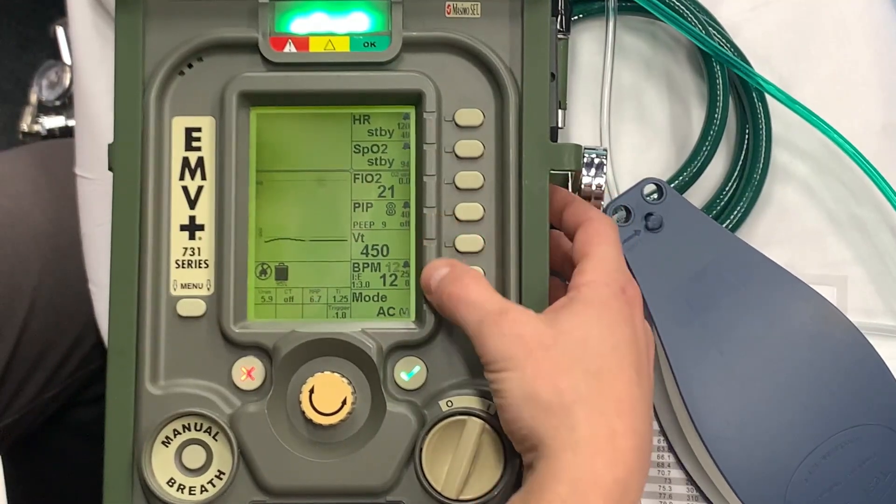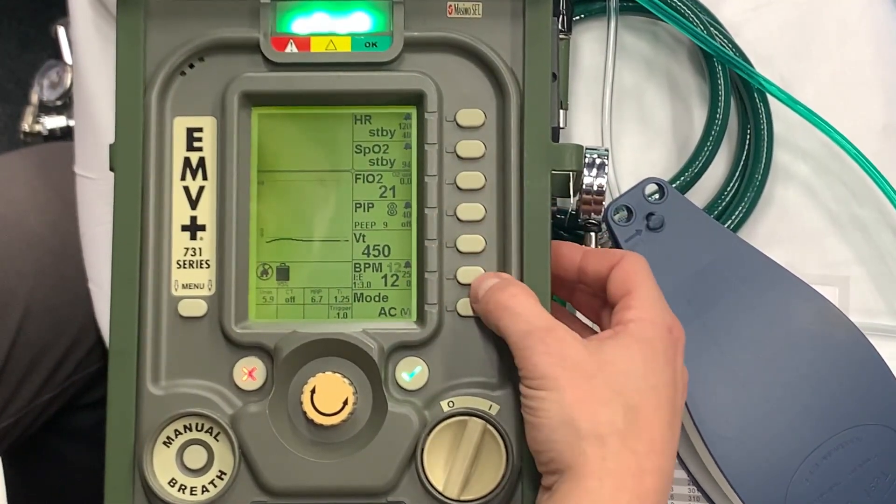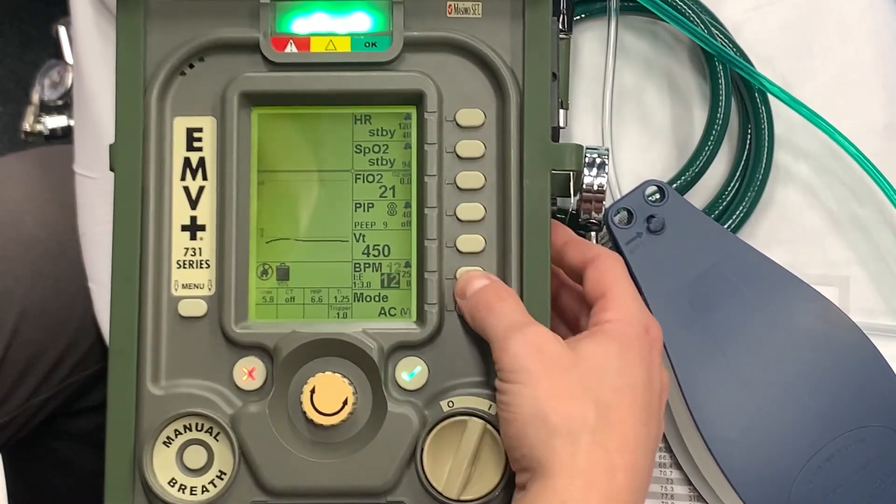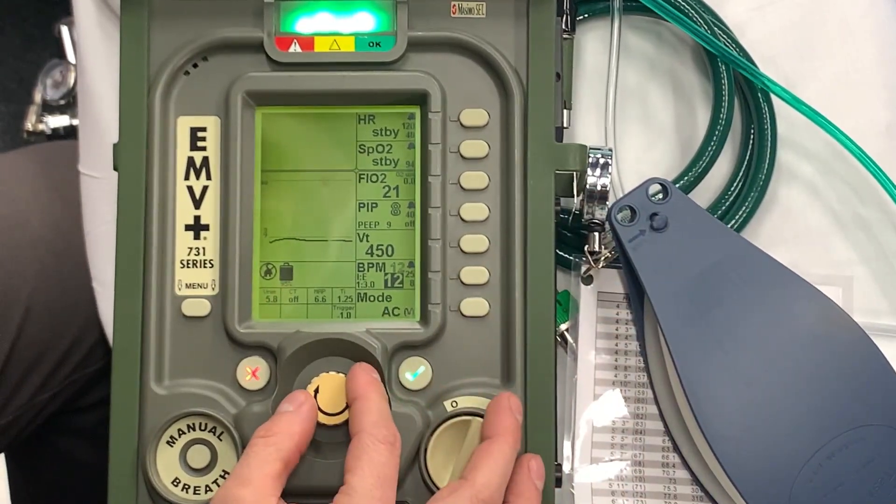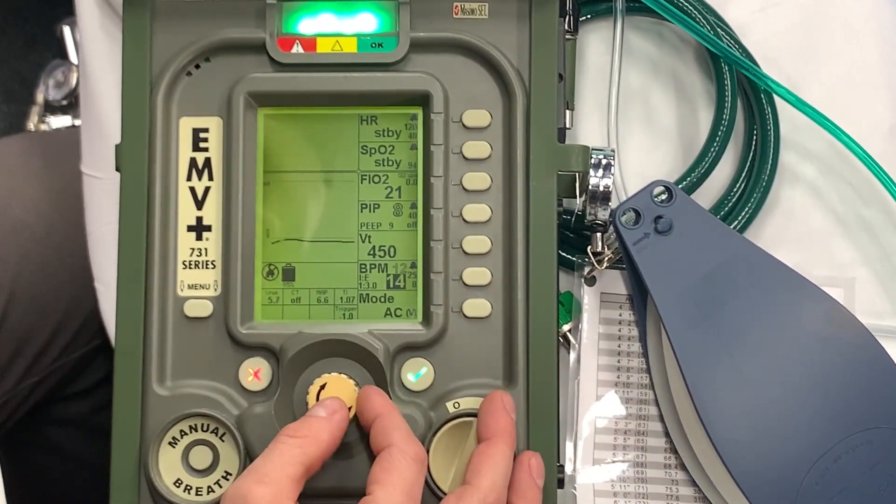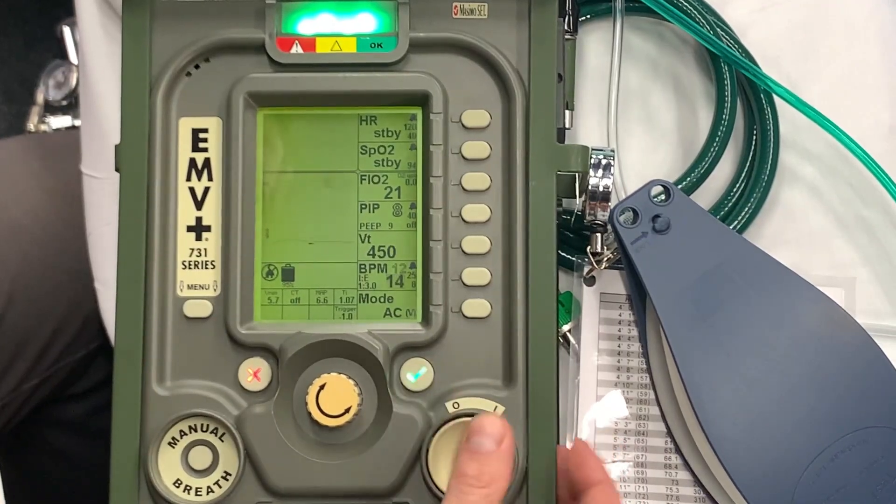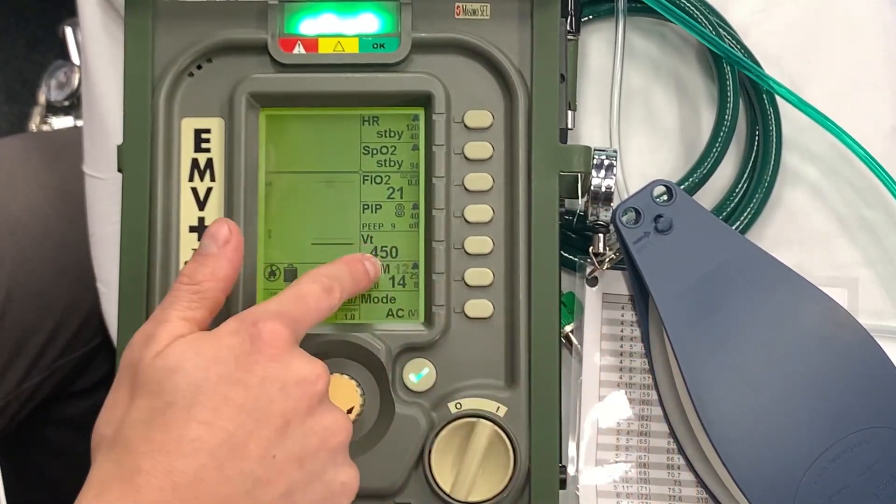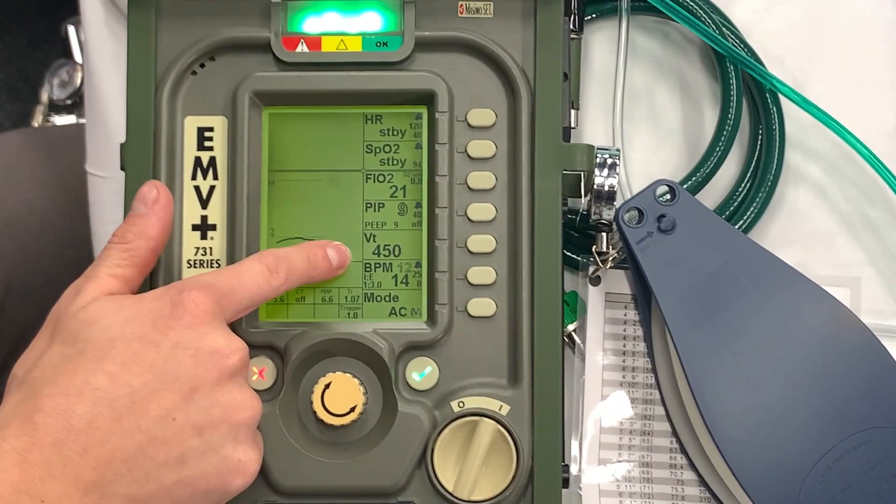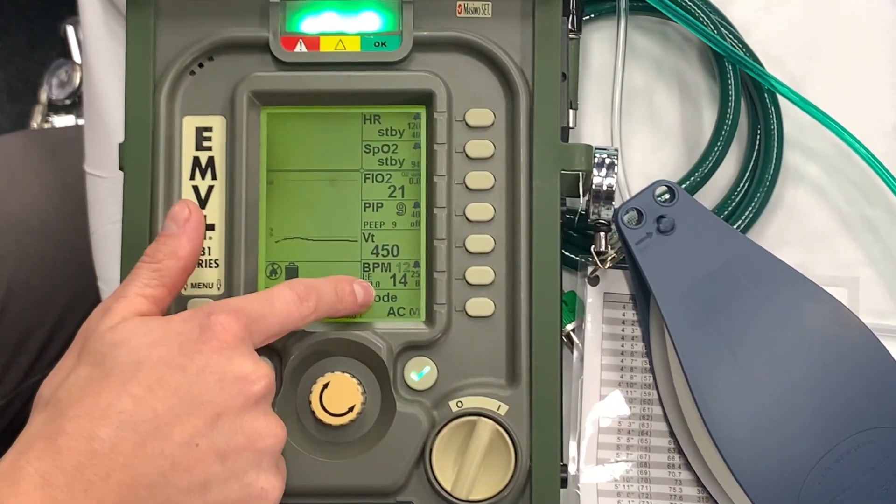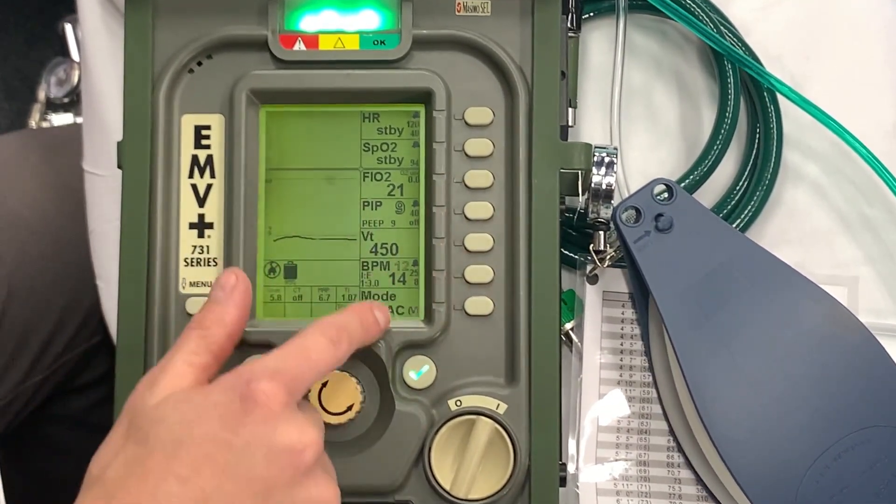At that point, what I like to do is come down to my respiratory rate. So soft key over to the right here, and I'm going to set a respiratory rate. Let's just go to 14. I have to confirm that. So now we have decreased our tidal volume from 500 down to 450 and increased our respiratory rate from 12 to 14.